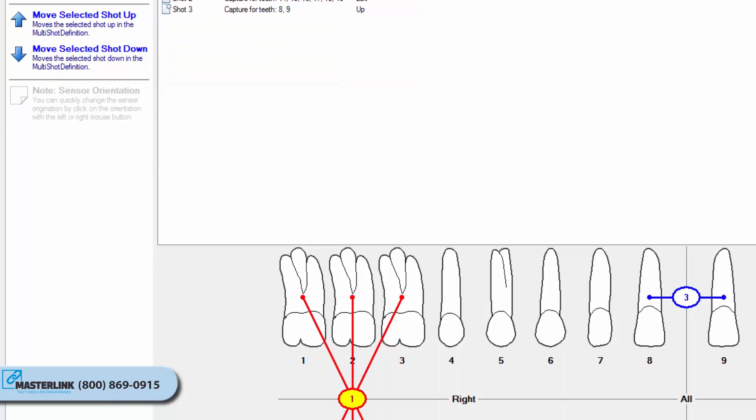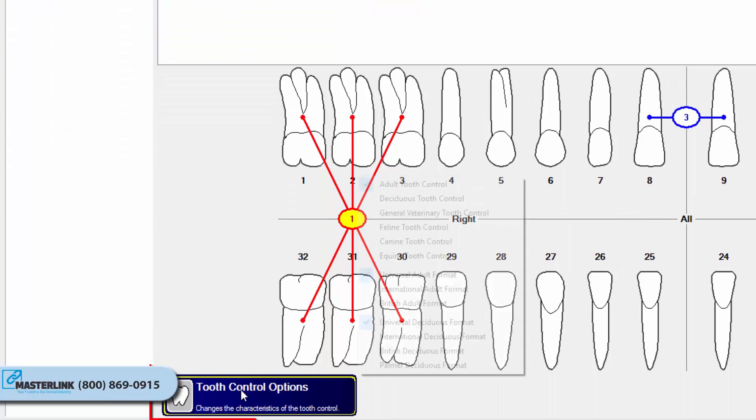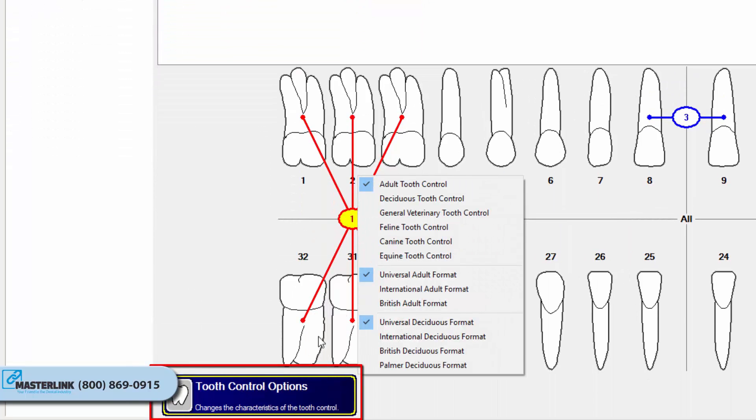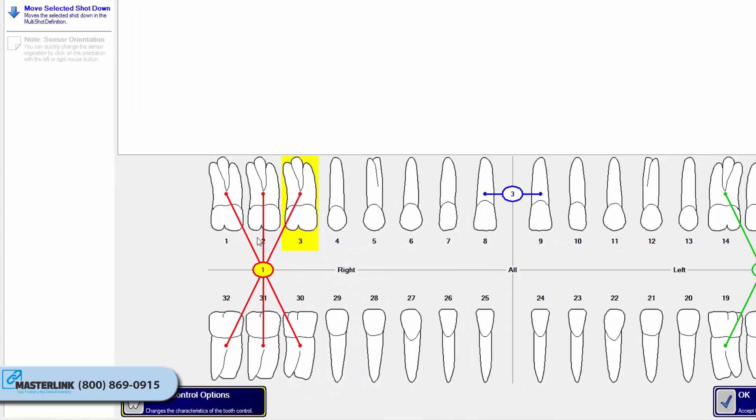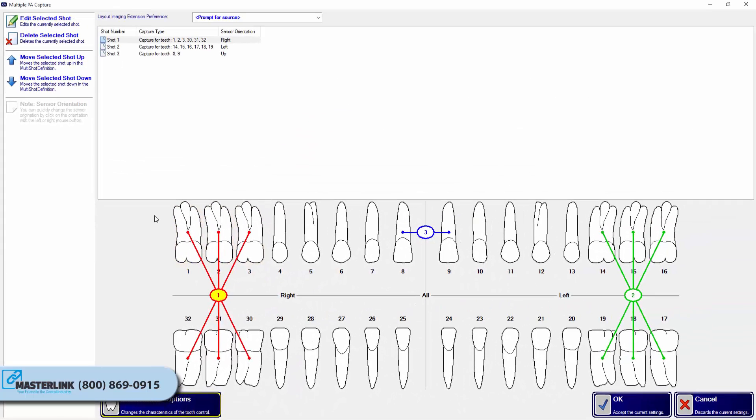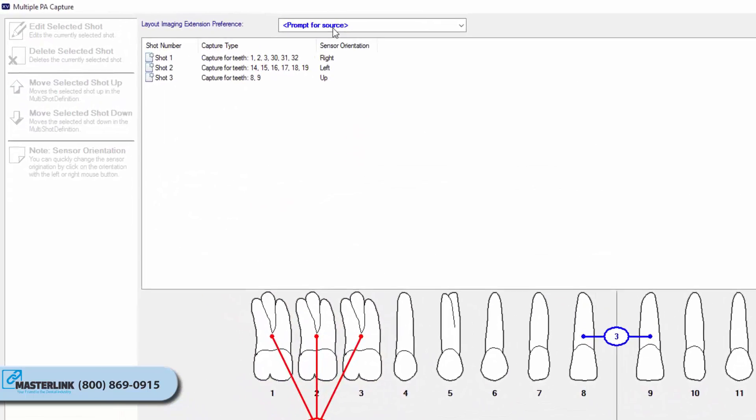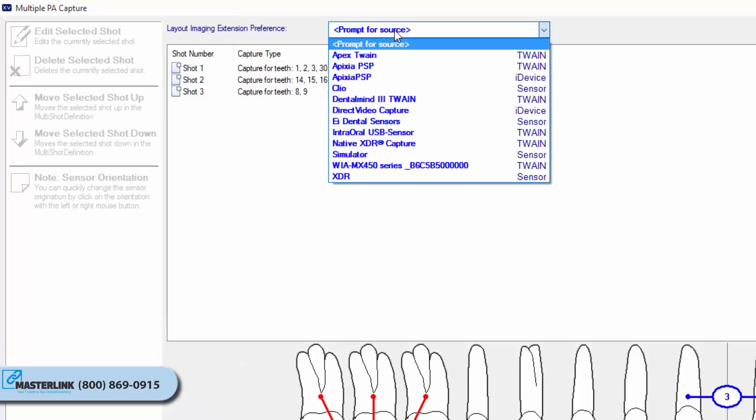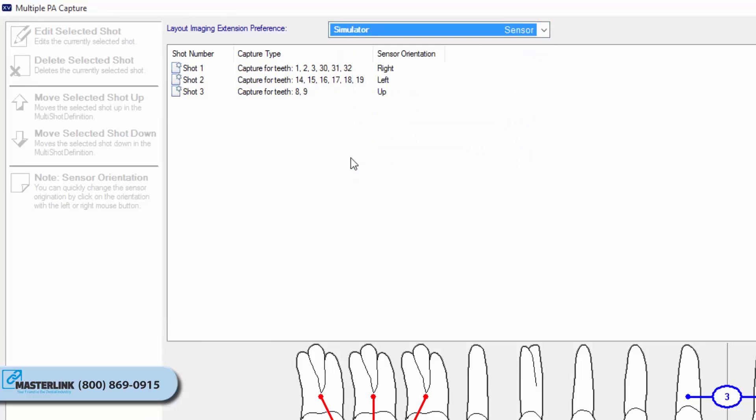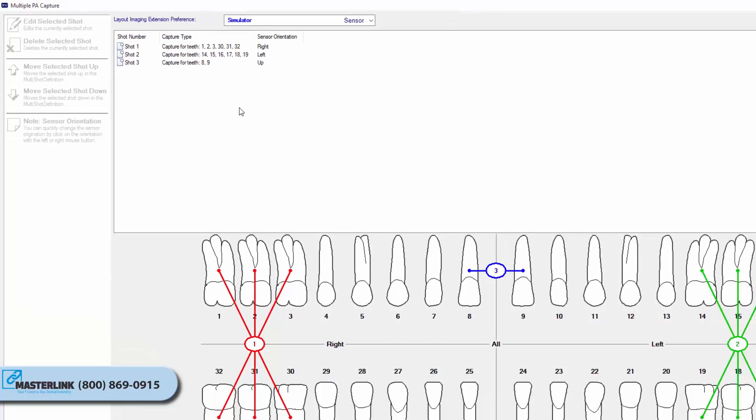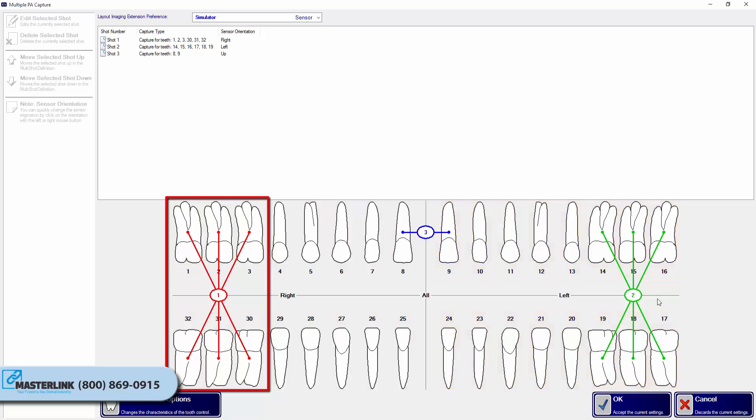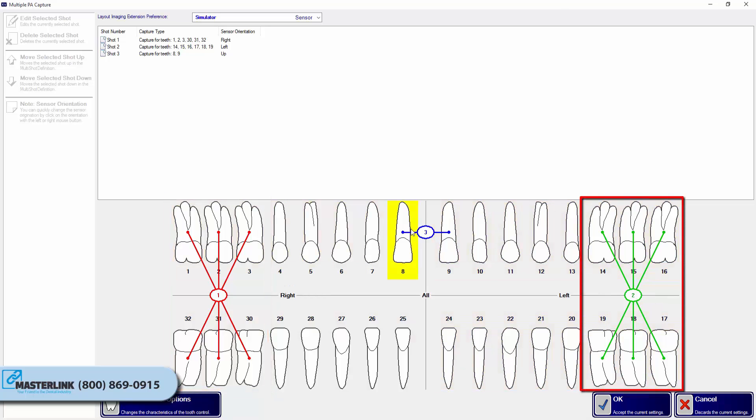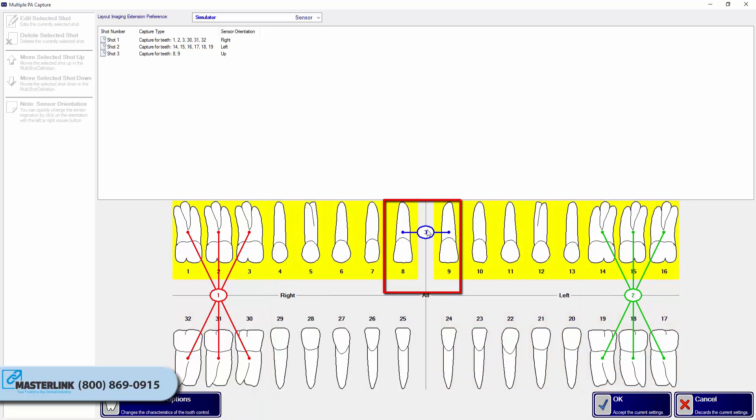Users can use the Tooth Control Options button to change between Dentition formats: Adult, Deciduous, etc. The Layout Imaging Extension Preference drop-down can be used to specify a capturing hardware for the layout. In this example, three shots have been created. The first shot is a right BW, the second is a left BW, and the third is a PA of tooth 8 and 9.